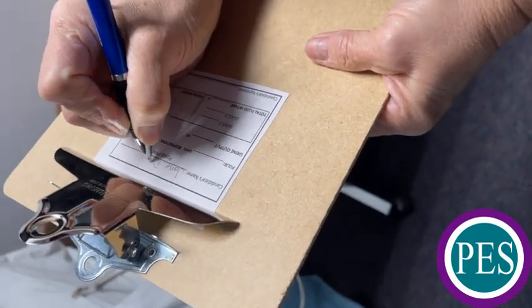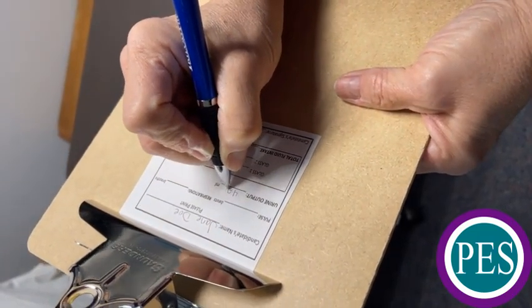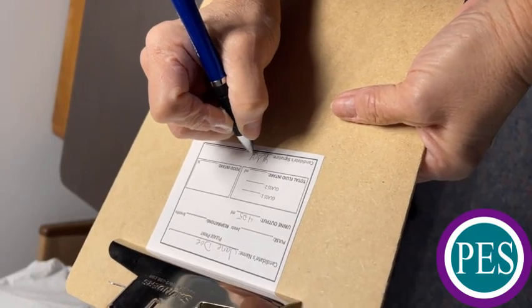Record the output in mLs on the signed recording form. The candidate's recorded measurement must be within 25 mLs of the RN test observer's measurement.